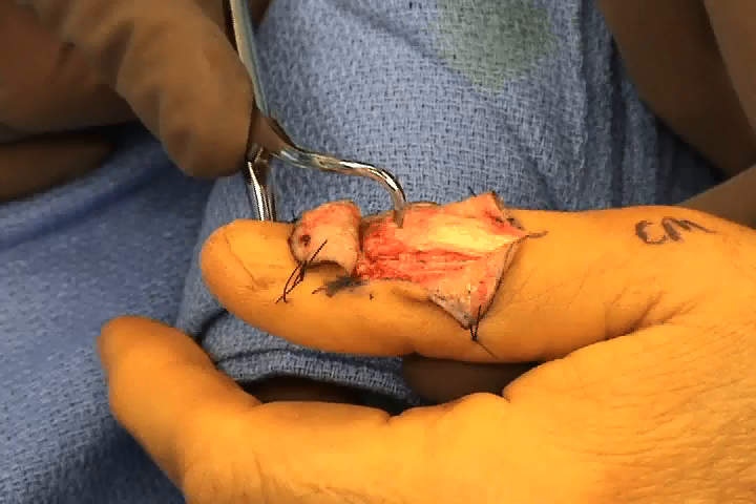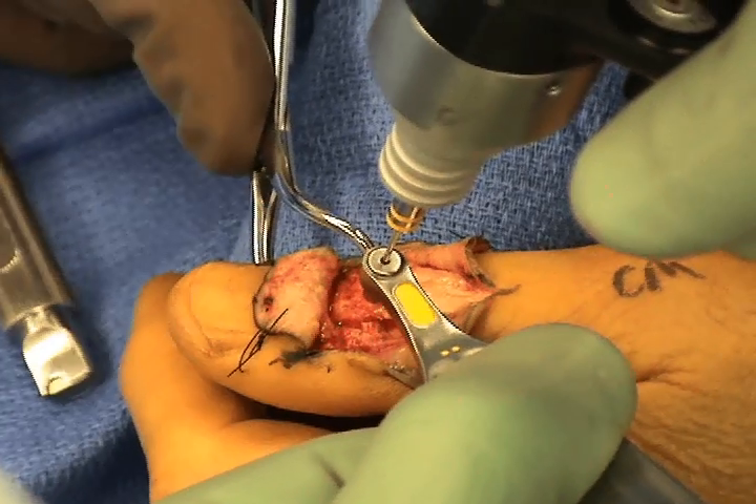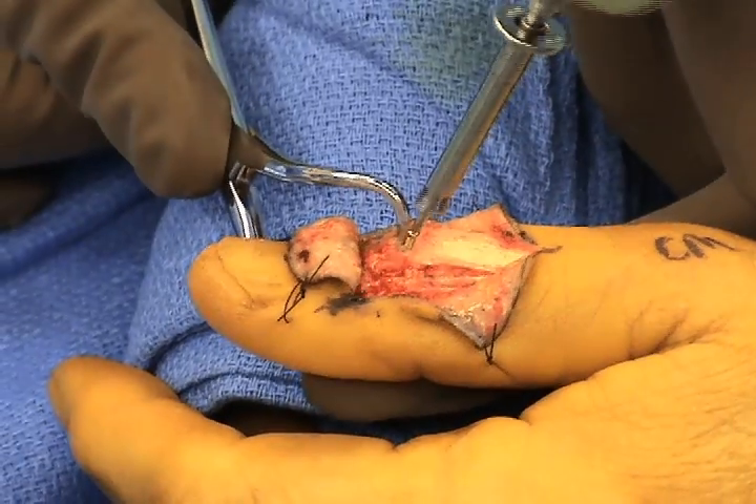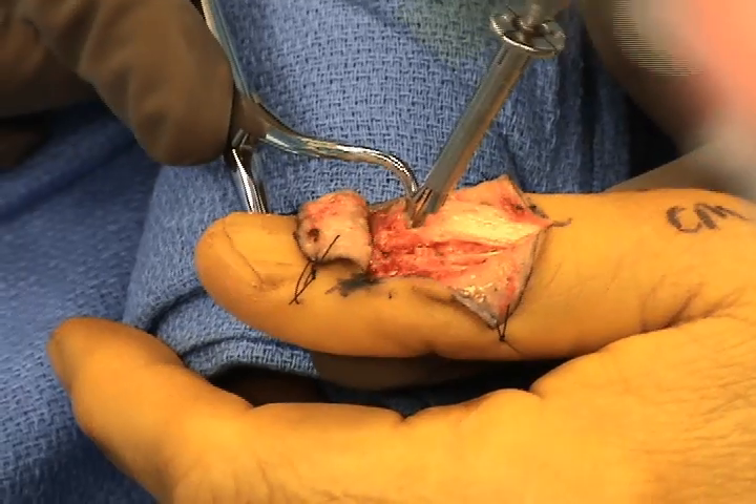Internal fixation is accomplished with screw fixation. These small 1.2 mm screws help to avoid the problem that cerclage wires can have with rotation of the fracture fragments.